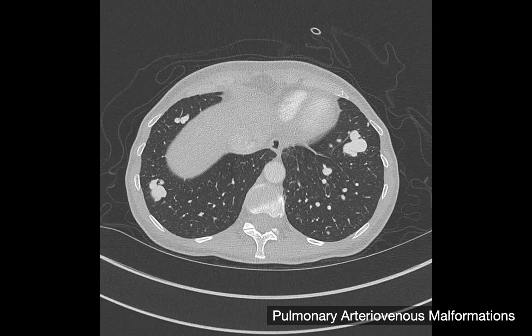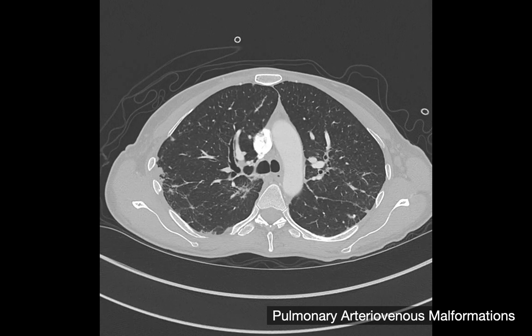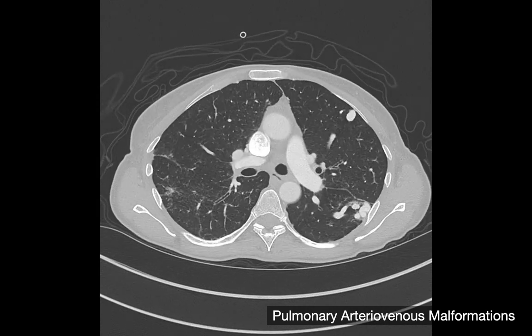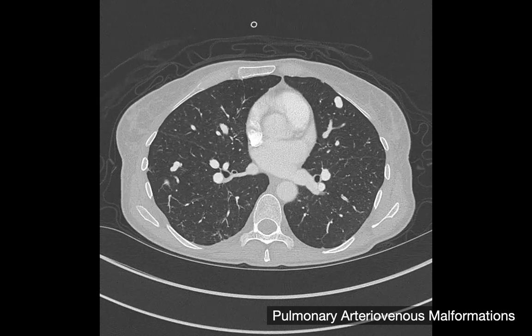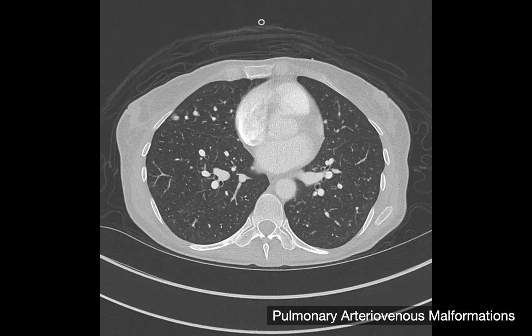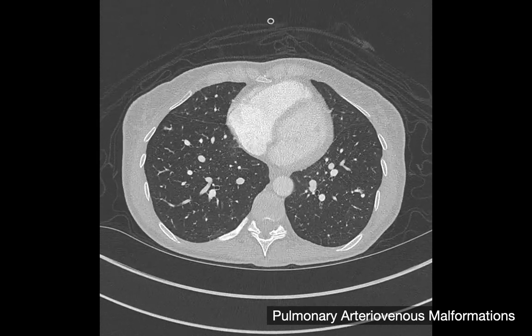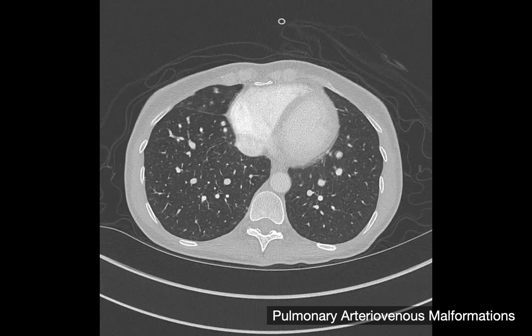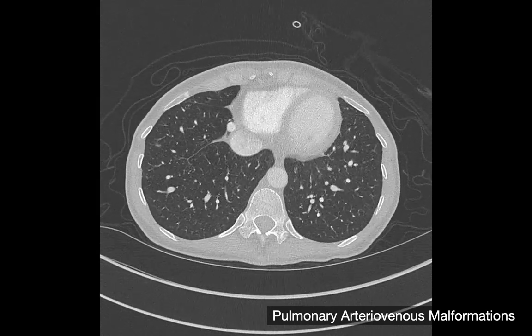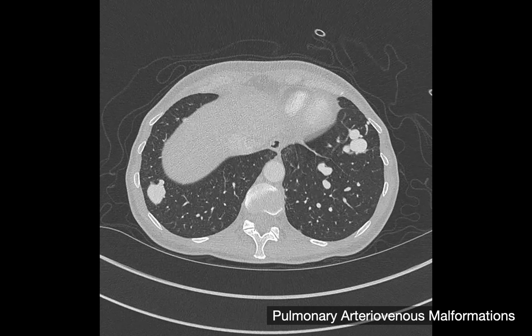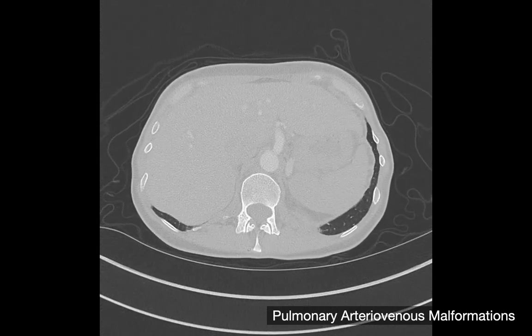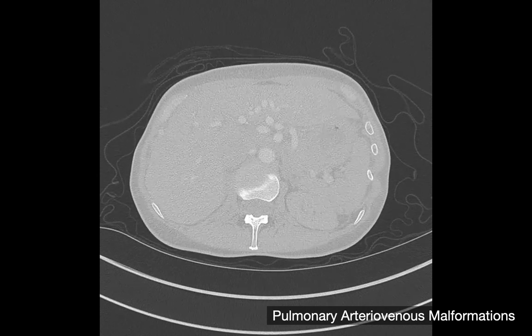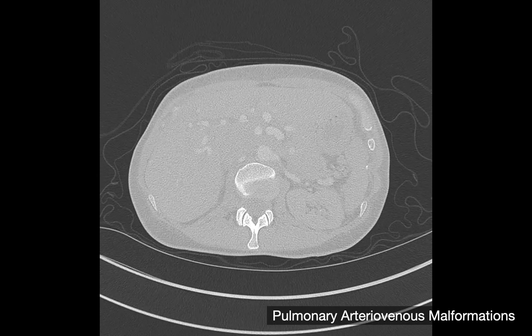Here are some examples of PAVMs in a patient. You'll recognize things that look like nodules or well-circumscribed opacities — they're actually just big bags of blood. Many of these have large, fat, serpiginous vessels feeding and draining them too. So what looks like well-circumscribed nodules is, in this case, PAVMs — not truly solid, but full of blood.